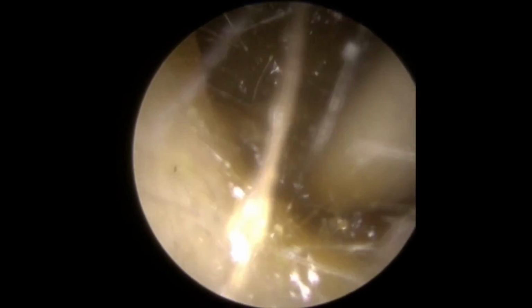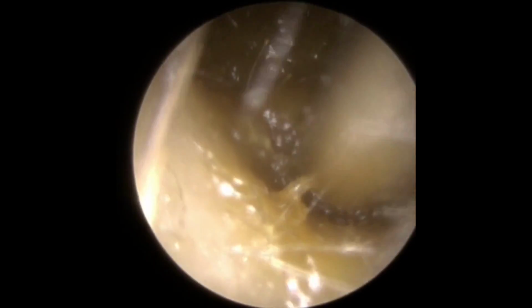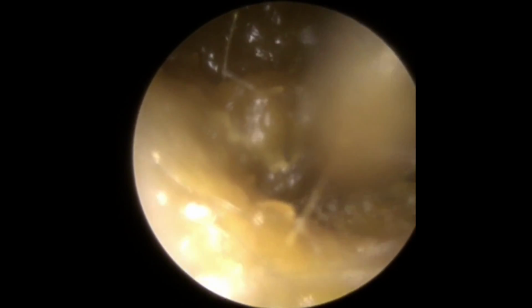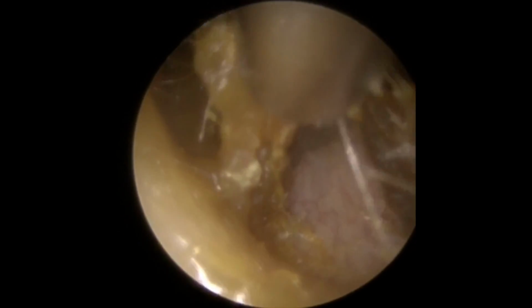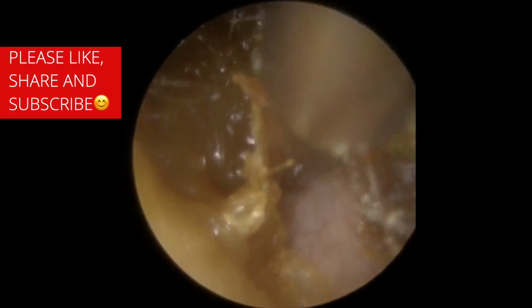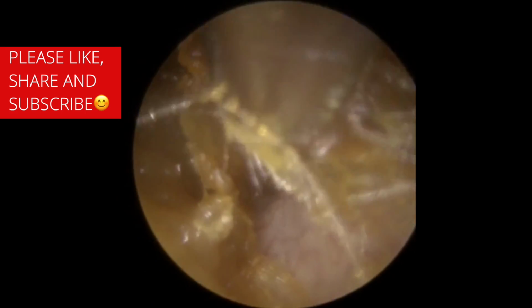If you imagine, gravity is always going to pull the wax down to the lowest point, so we spend a lot of our time upright, so you're going to find that a lot of the wax ends up sitting at the base of the canal, so it usually really gets stuck there. So I always find it easier to remove from that section first, and then you can see now we've got a good gauge point as to where the canal walls are because we've uncovered it at the base, so we can start working our way around the outside edge now.